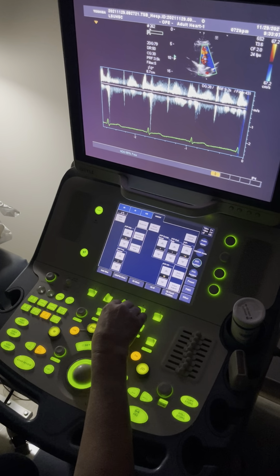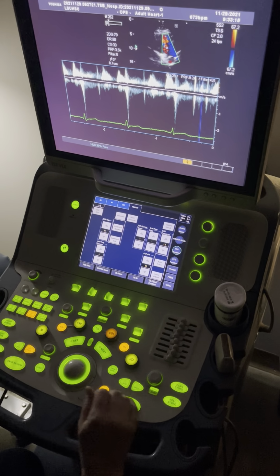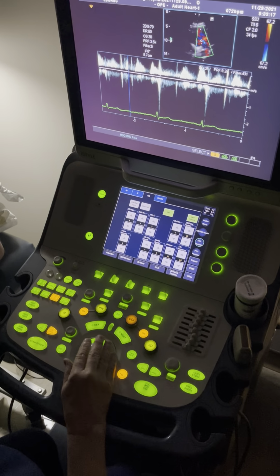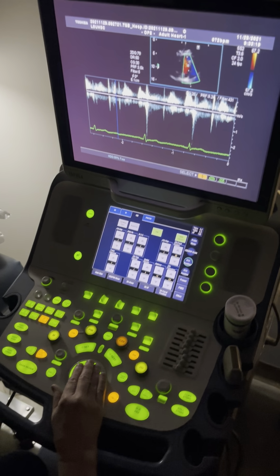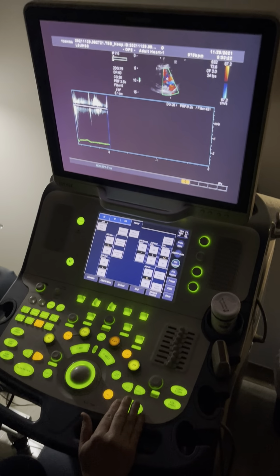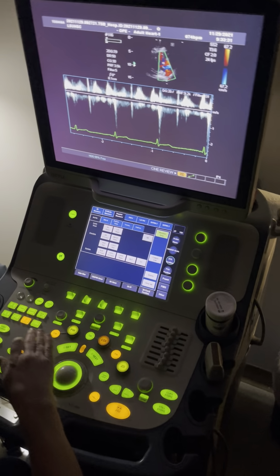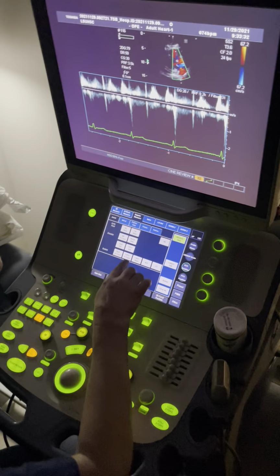That's what the sound is like? I don't hear his like I was hearing Kyle's. If I hear it, I'll tell you. Why does it sound like that? The speakers on the machine. Trash. I'm like, wait, it sounds like a lot of TR for me. No. So I'm just going to pretend that this is TR.